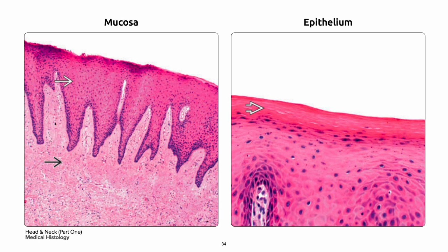On your left is the oral mucosa that is composed of 3 layers. The epithelium in white single arrow, with its distinctive rete ridges, is easily discernible from the underlying lamina propria in single black arrow. The distinction between the lamina propria and the submucosa is not always as obvious. The submucosa may contain fat, glandular tissues, the nerves, and the blood vessels.